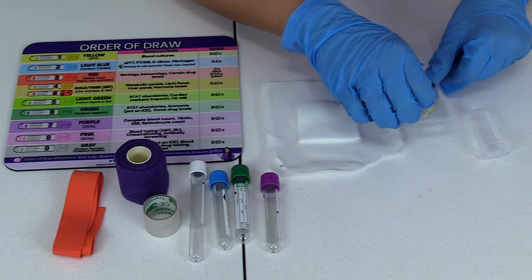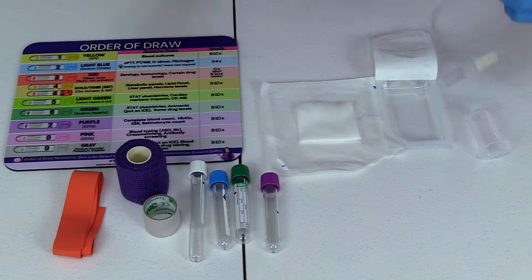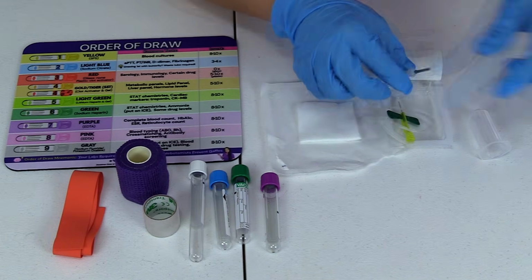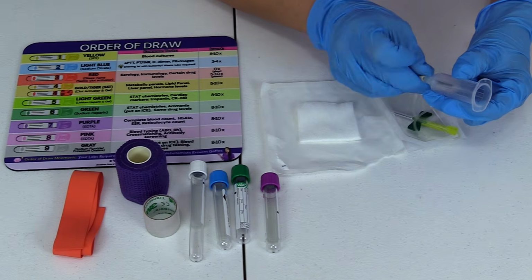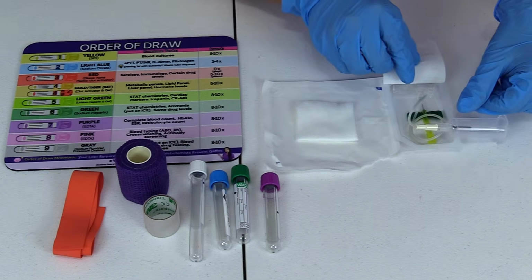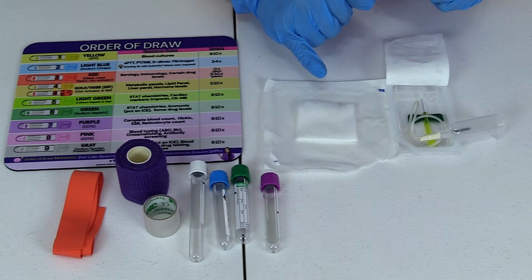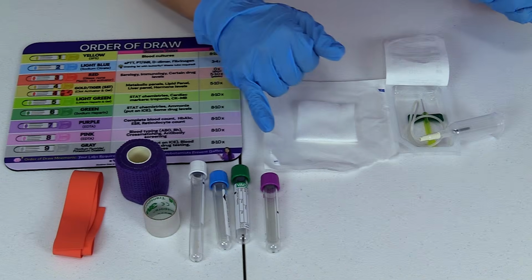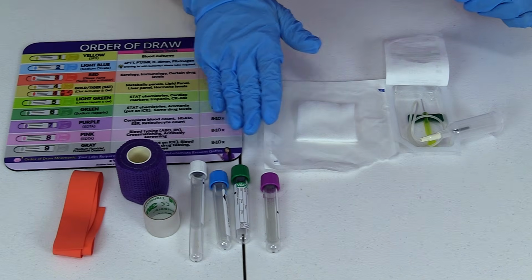So I'm just going to take this out right here, and I'm going to leave this part in there, but I'm going to go ahead and screw on to this. I'm going to leave that there. And then I have my gauze, which I'll need to place over the site once I have removed the needle. And then the other super important part are your tubes.